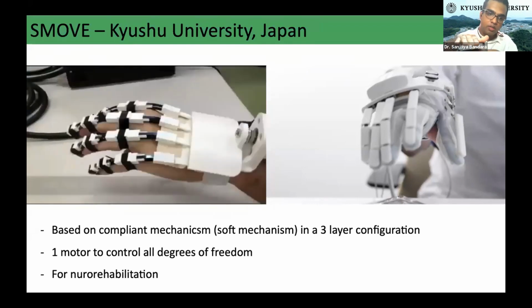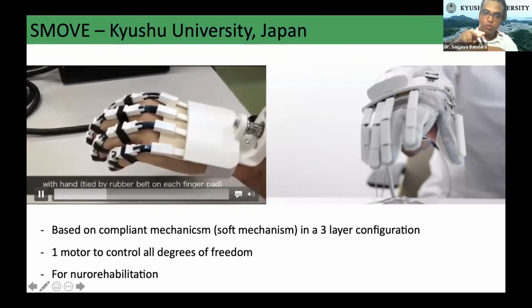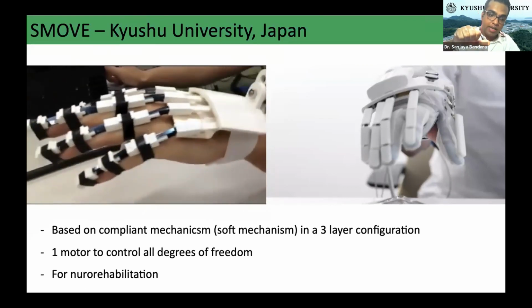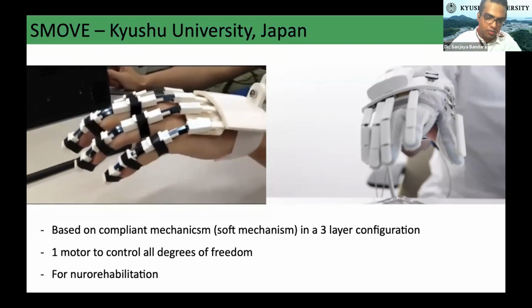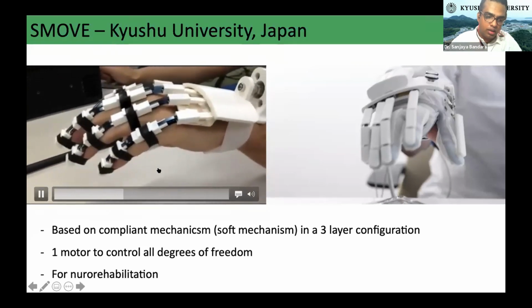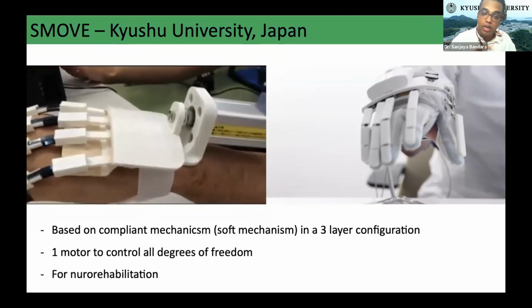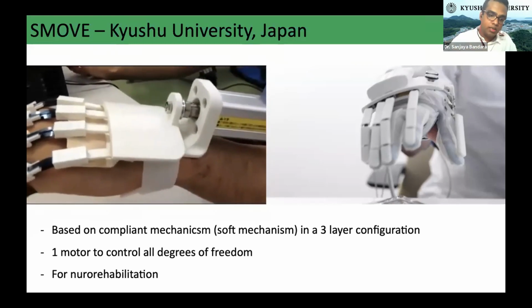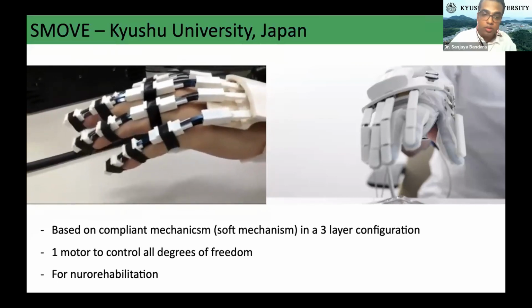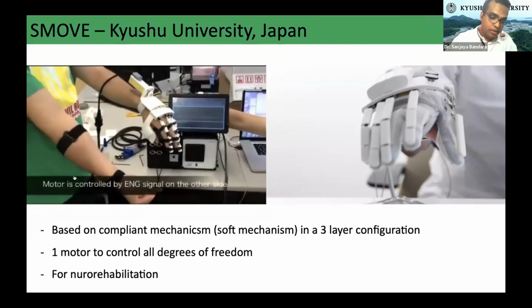So we push one layer of springs with this motor, as you can see, one linear motor. This will bend the fingers of the hand robot. And we only have one motor to control. I heard in yesterday's presentation, Mr. Pugudu was talking about underactuation. So this is underactuated. It is important because a prosthetic hand or exoskeleton needs to be lightweight.